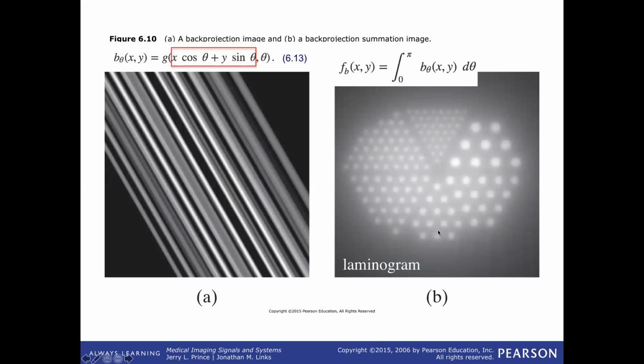And we get this. Again, you're quite familiar with this now, in that you have brightness where brightness should be, but you also have a lot of brightness outside. So the edges of these circles are blurred, and there's a lot of stuff in the background that should just not be there. You can see why, because there's a lot of stuff put into the background around your object, or around your target.